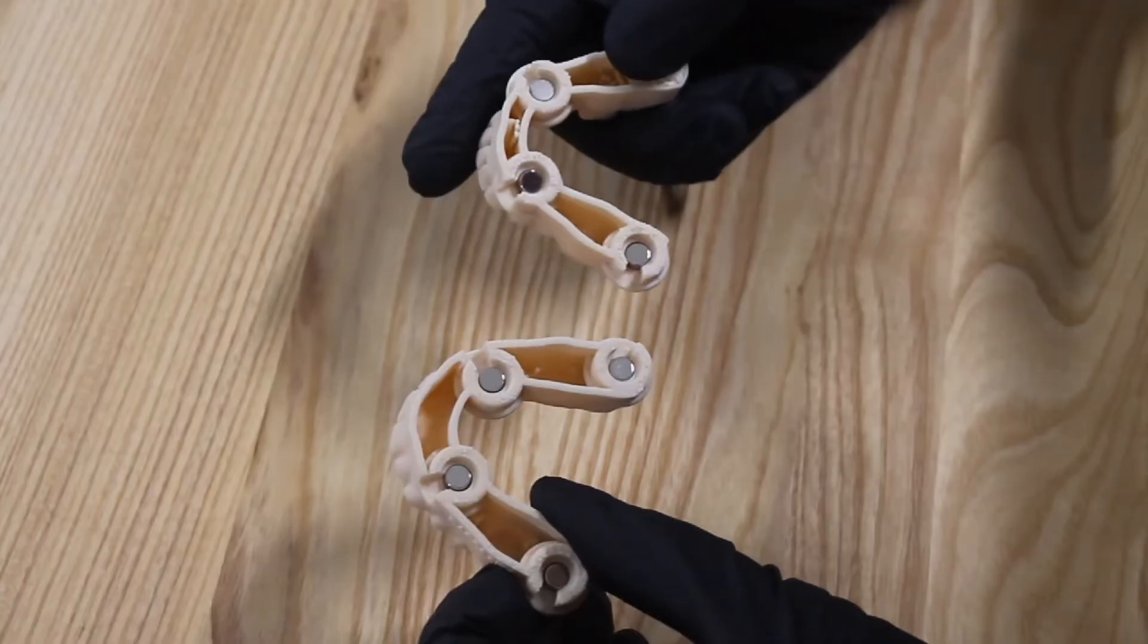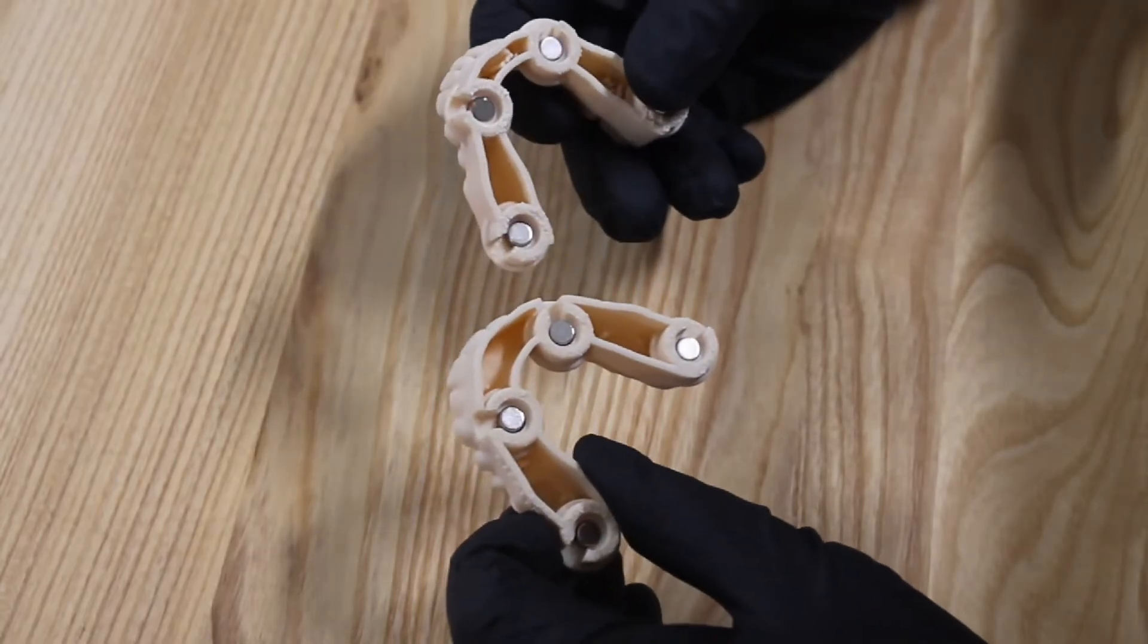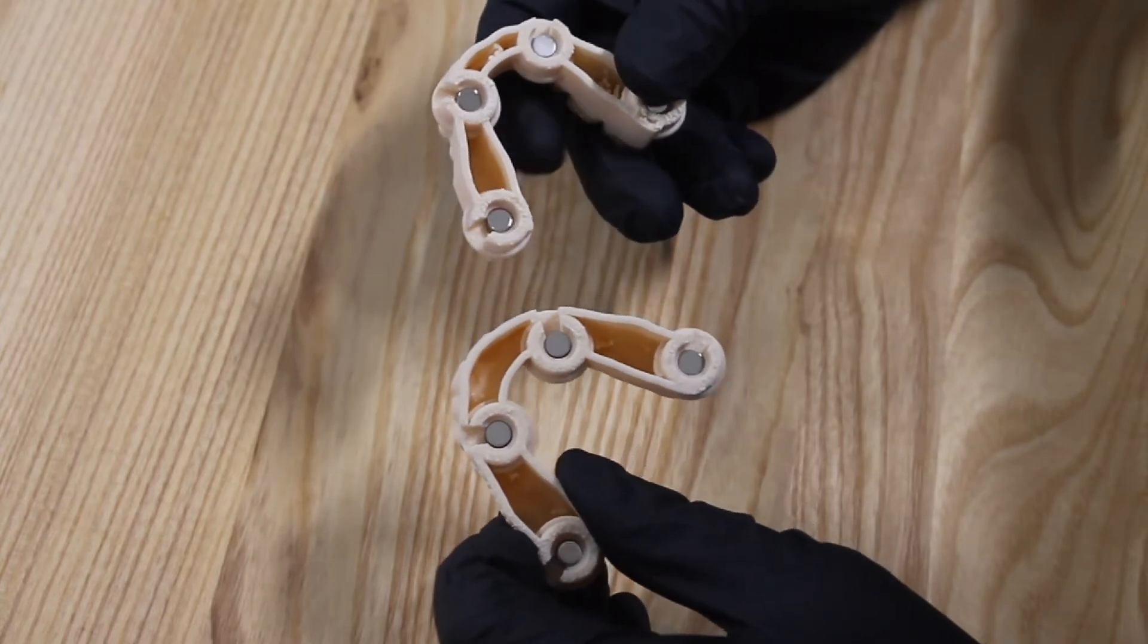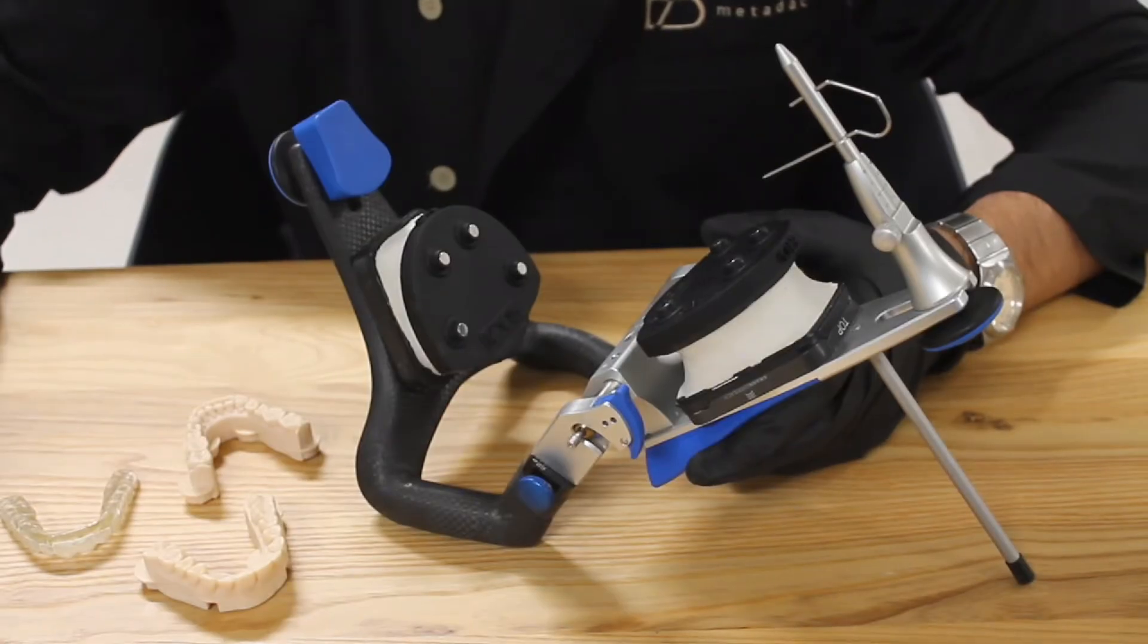Once both the upper and lower models are ready, you can position them back into the articulator. In this example, we are working with two models for a splint application.